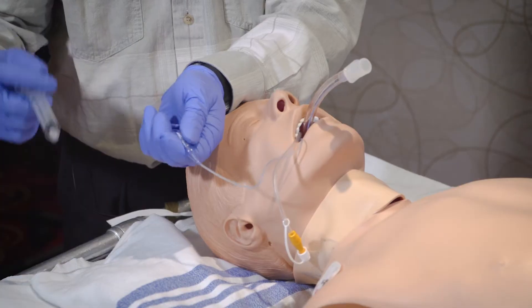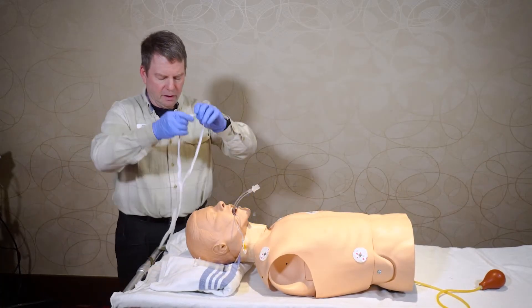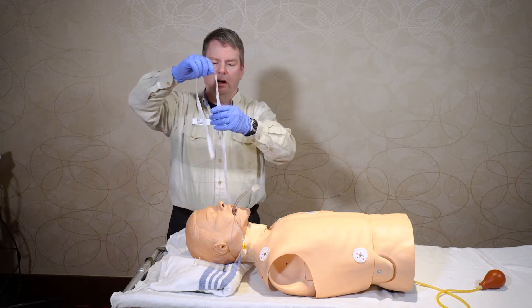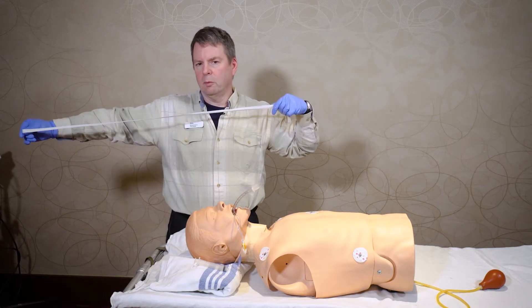So you would inflate the cuff, remove the syringe. Somebody would be holding the tube in place, and then if you have a twill tape, just take a regular twill tie and make it about two arms lengths.